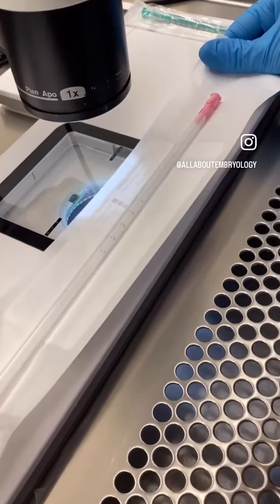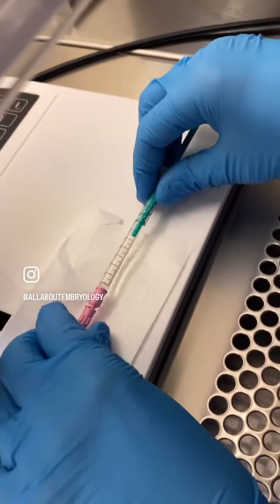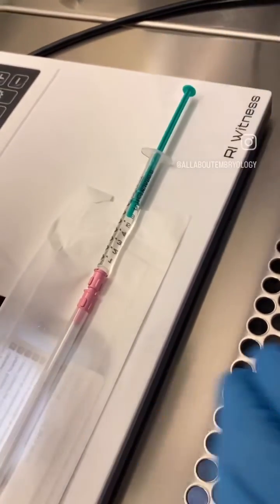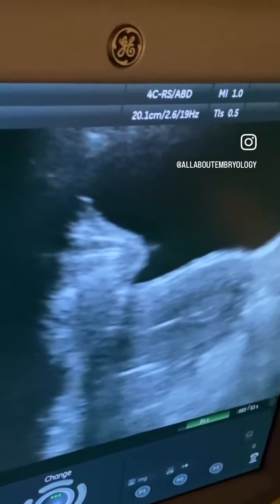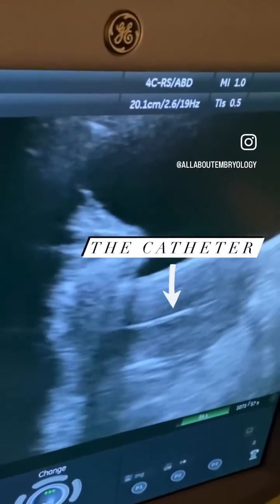The catheter is opened in a sterile manner and a syringe is filled with pre-warmed culture media solution. The doctor will get the patient ready and in position. An outer guide catheter will be placed through the cervix and into the central part of the uterine cavity.